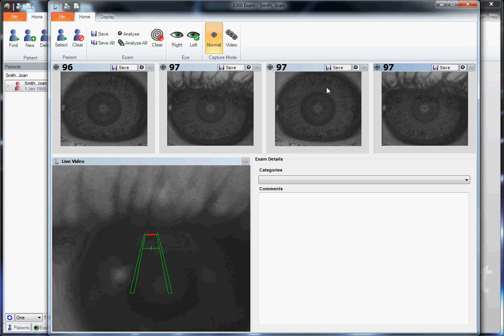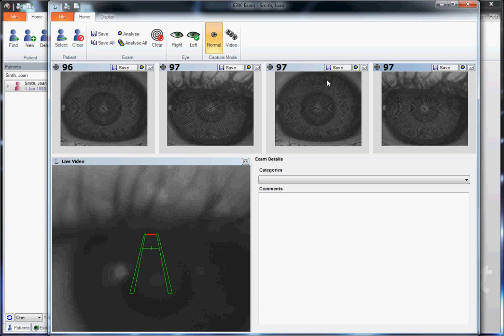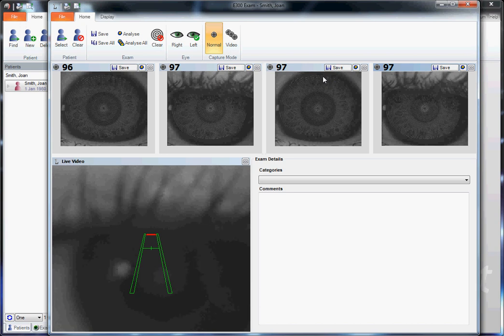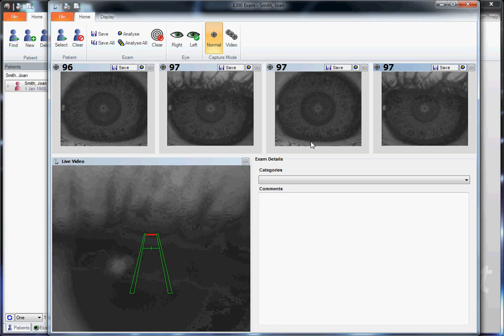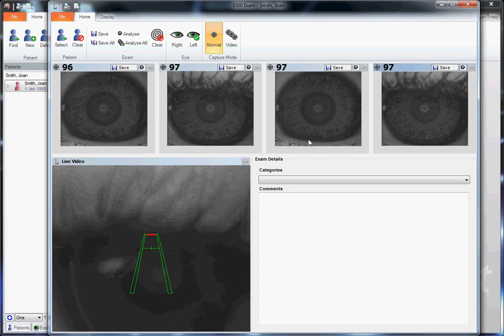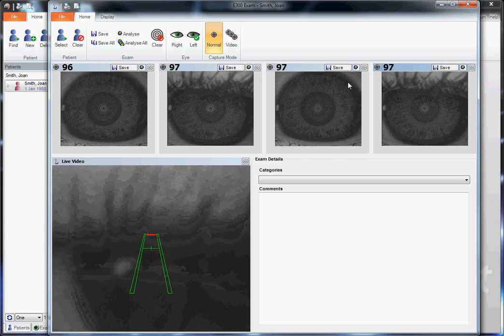Here we see the eyelash shadows minimized, the upper lid out of the way. However, the lower lid appears to be blocking much of the inferior cornea.